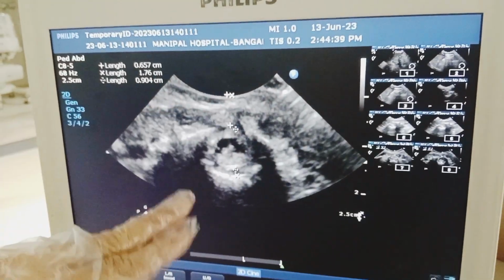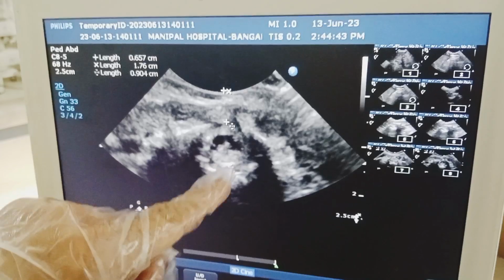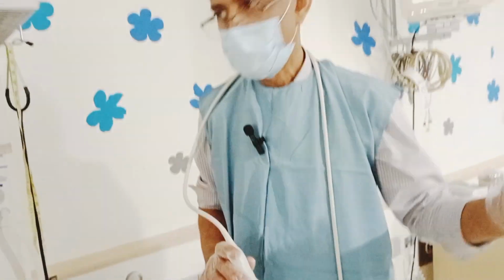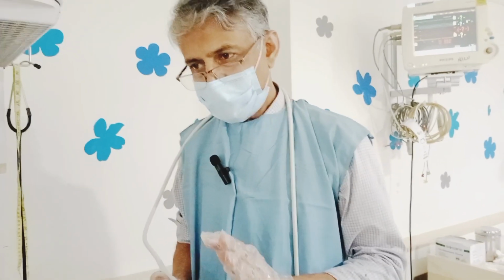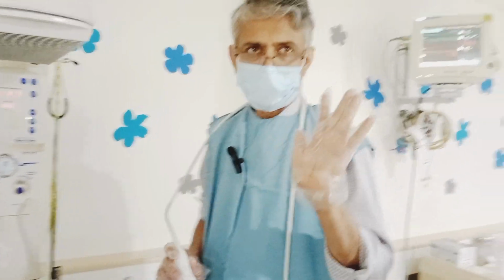Using these three, we can calculate the mid spinal canal depth, that is nothing but half of the spinal canal thickness plus posterior spinal canal depth. All right. Now this is just to make sure whether it is equal in all the positions or not.